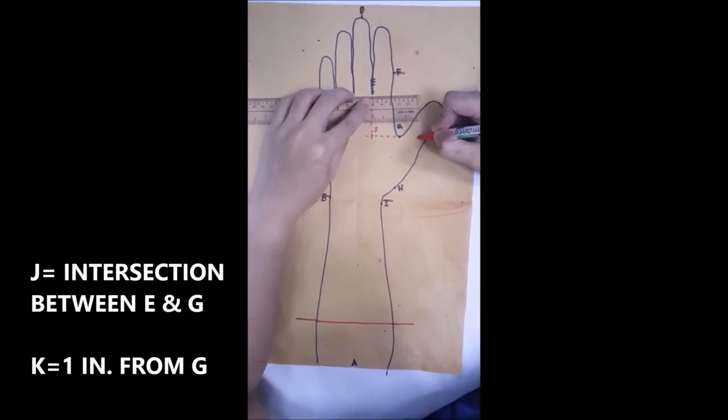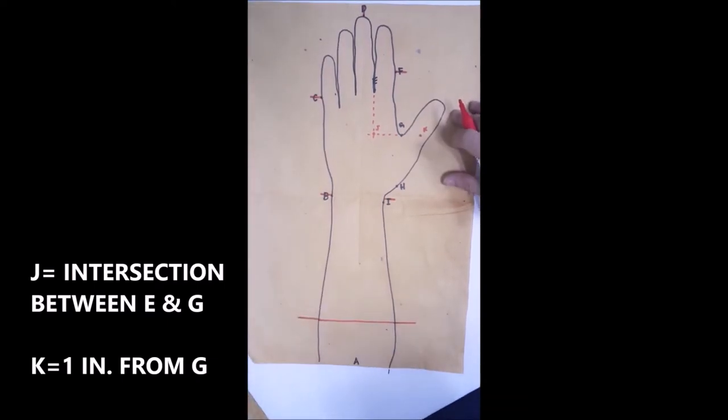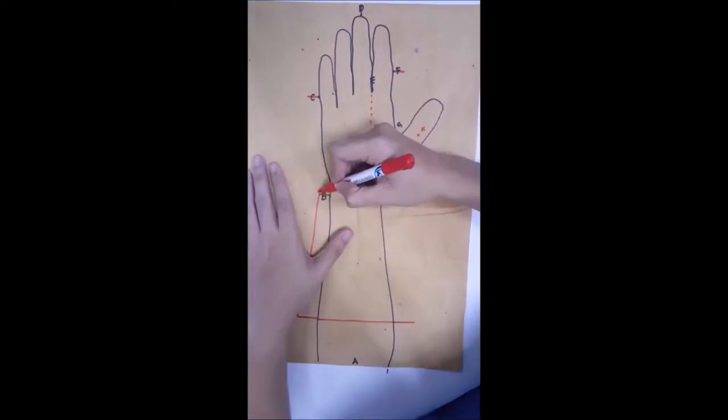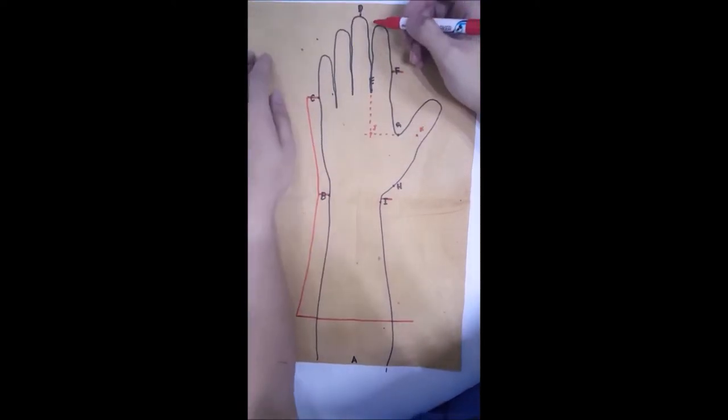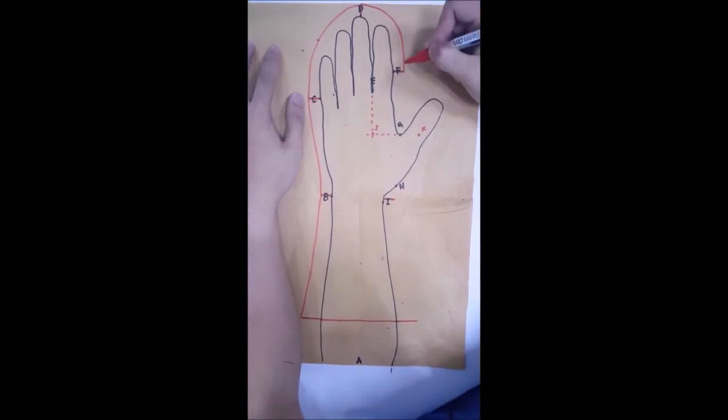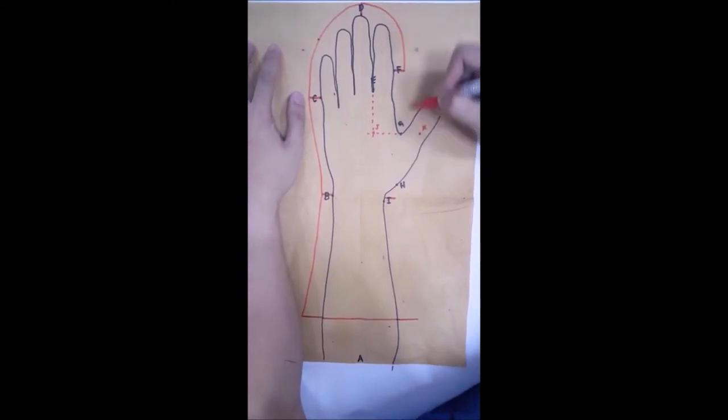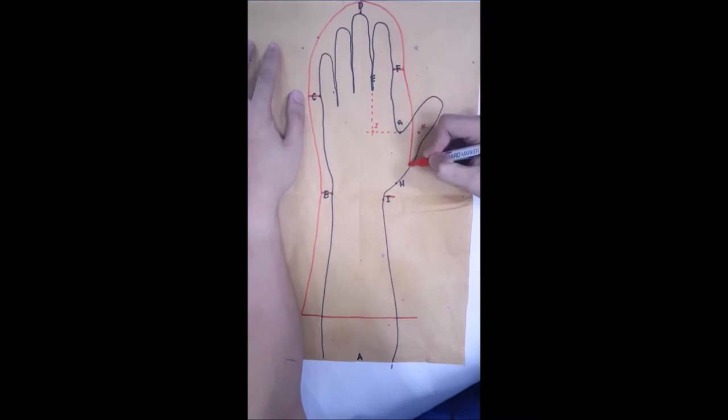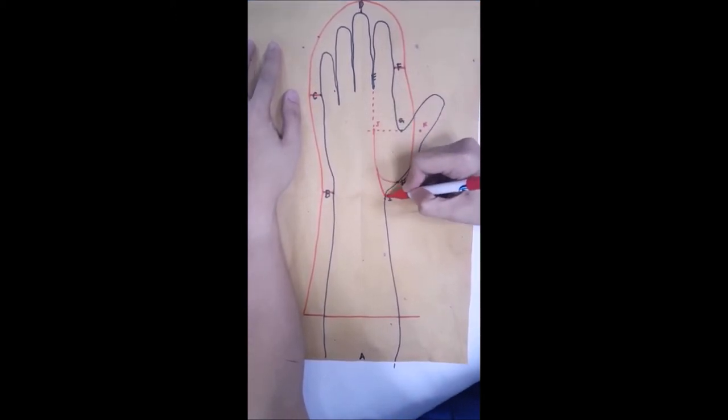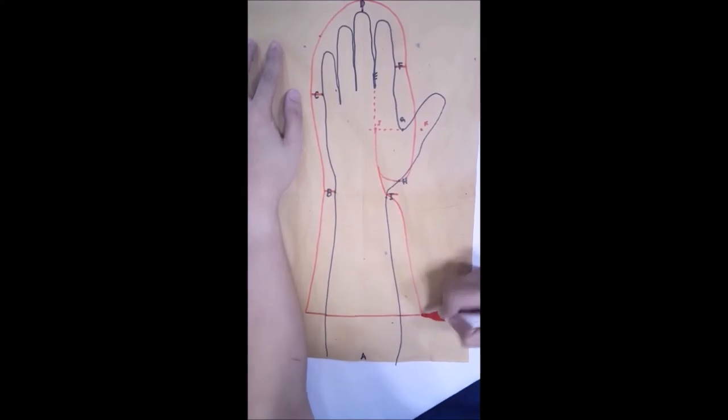Then mark K one-inch from the radial side of G. Connect the line from the forearm to B, C, D, F between G and K, curve going to H, vertical line to J, and connect I at the line of the two-thirds of forearm.